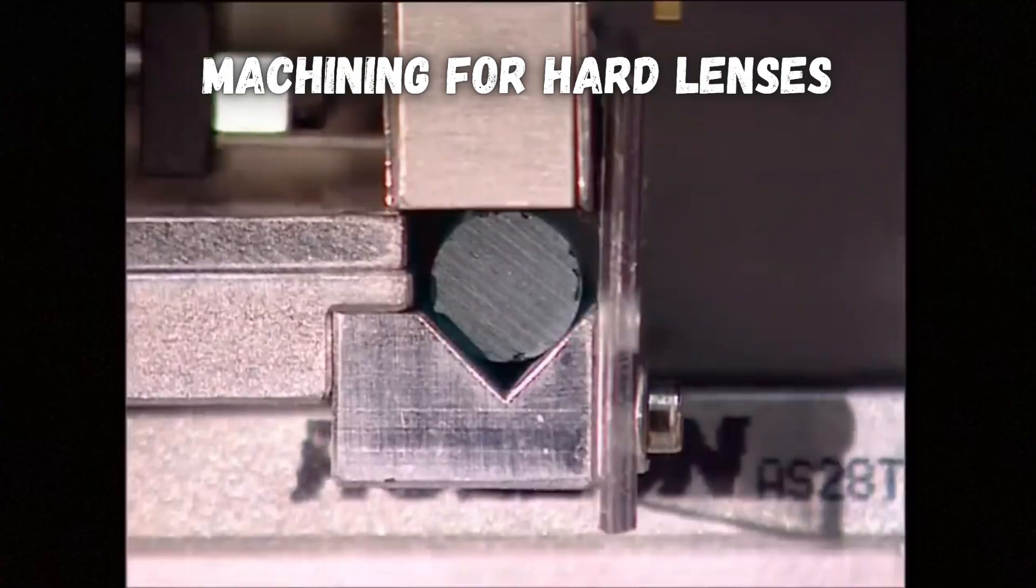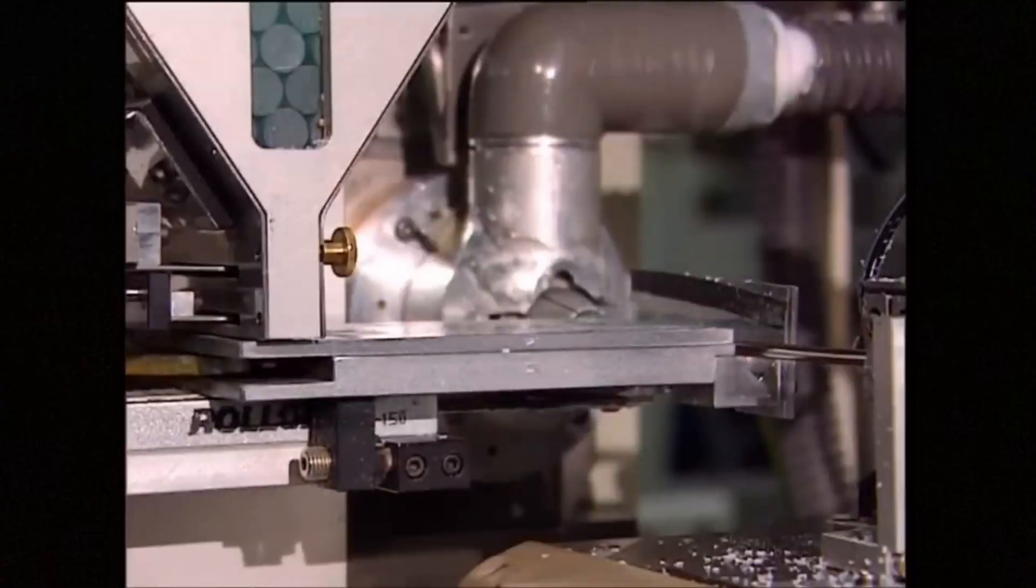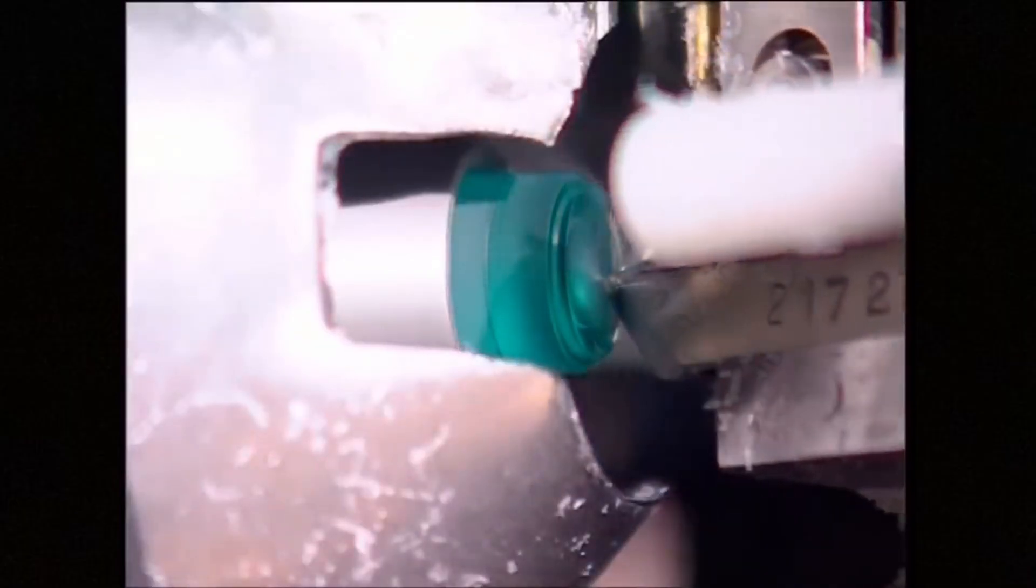What about hard lenses? Instead of molding, the rigid contact material for hard lenses is mounted onto a spinning lathe and precisely shaped using diamond tipped tools.